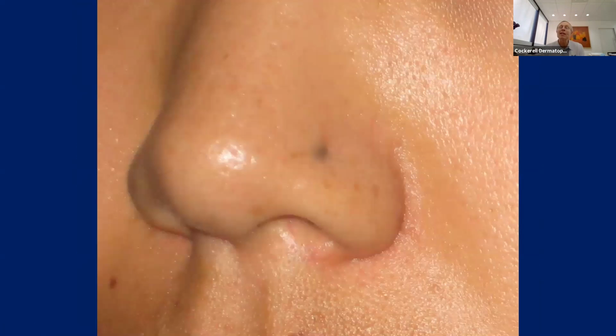Okay, now notice what's happening in argyria. It's actually staining, precipitating on the elastic fibers. And that's helpful because basically what's happening here, this isn't really an inflammatory disease. This is almost like an in vivo special stain. And there's two ways to get argyria. There's one way, if you drink silver-containing products or you use silver-containing eye drops or nose drops or something like that, that's a systemic argyria.